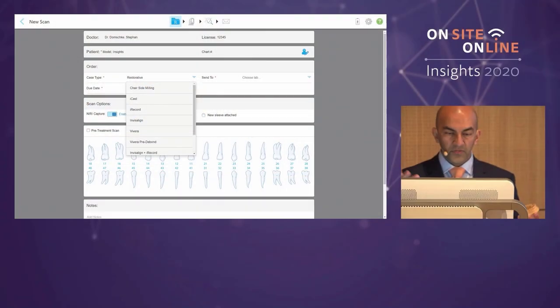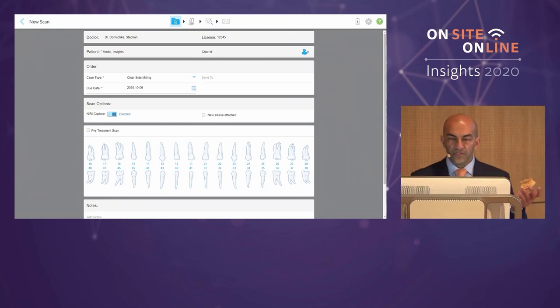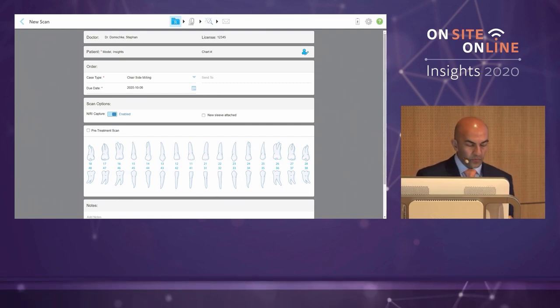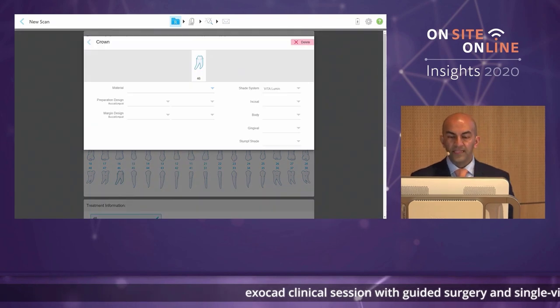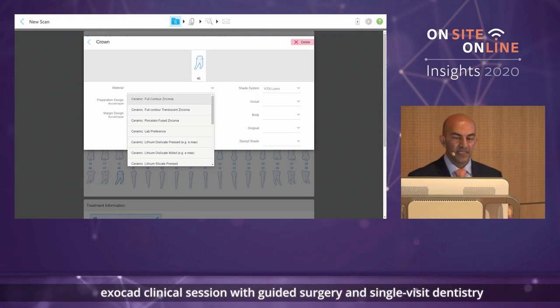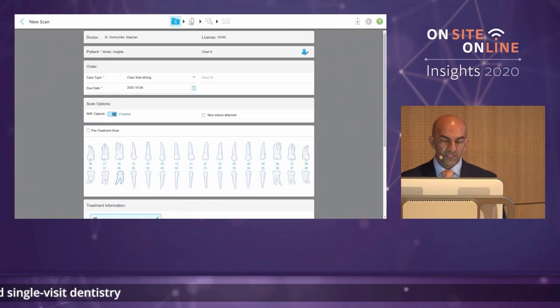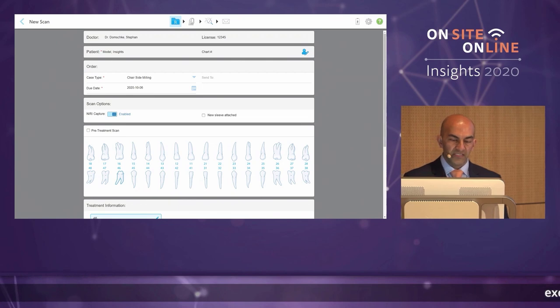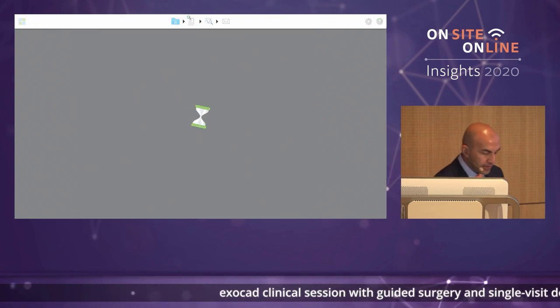This is a test model. I'm going to scan it as if you were practitioners scanning a real prep in practice, using the iTero scanner. Because we're doing chairside milling, your support colleagues will set up your hardware so that chairside milling is an option. We select that first, put in the patient name — here we're calling it 'insights model' — and for this case we're doing a lower right six, tooth number 46, and we're going to do a crown. We then choose the material — in this case I'll say lab preference — and enter the shade, which is A2.